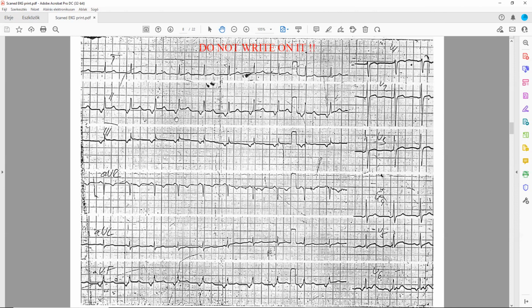That's great. What does it mean if you have exactly the opposite of the P wave that we should see?